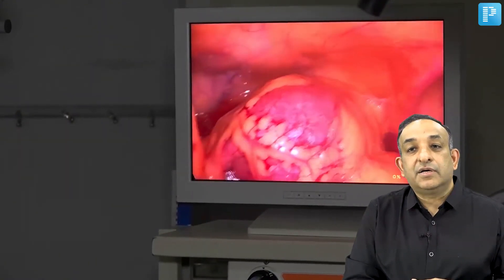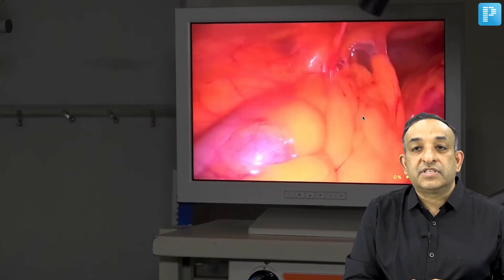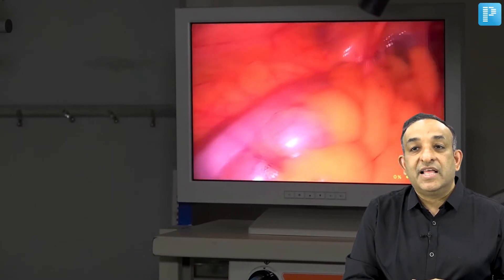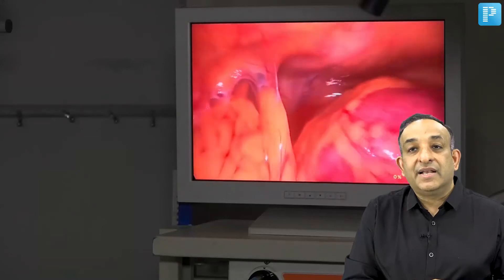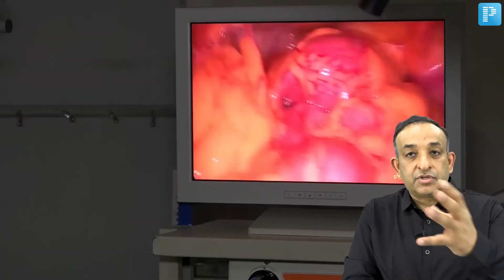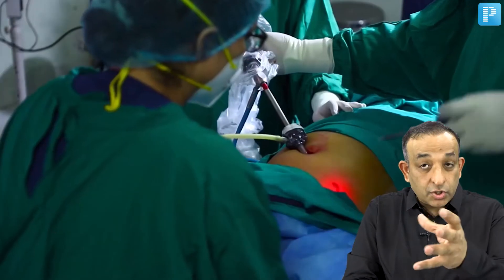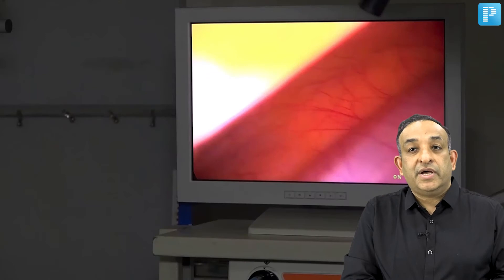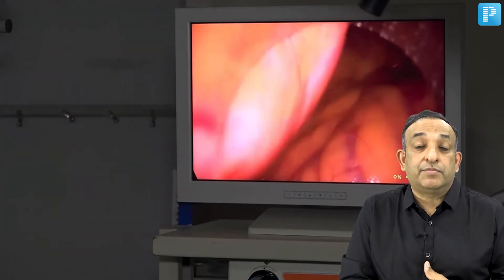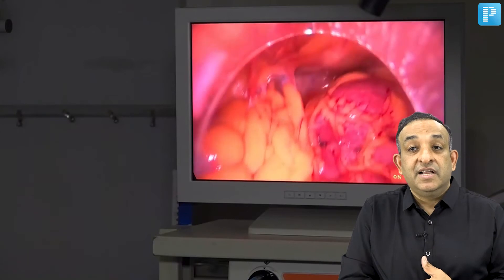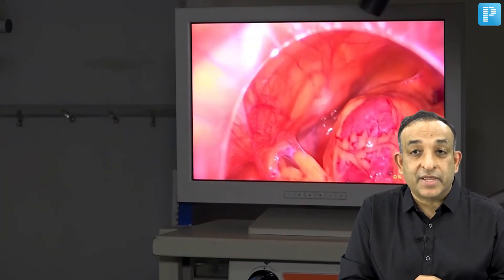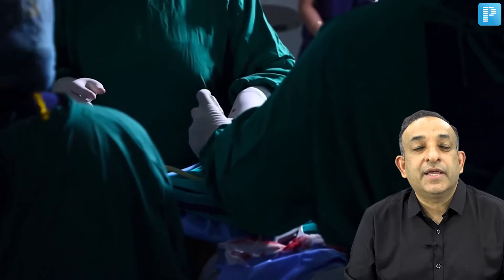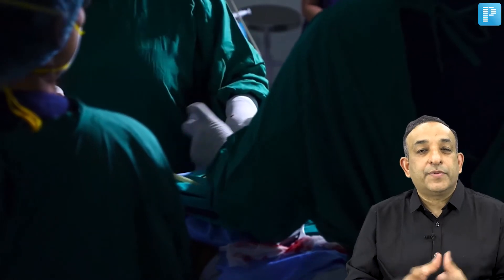The entire uterus is covered with omental adhesions, with adhesions to the left side of the abdomen and to the bladder as well. I now know there will be a problem, and what was planned as a diagnostic laparoscopy has become an operative laparoscopy requiring extensive adhesiolysis.